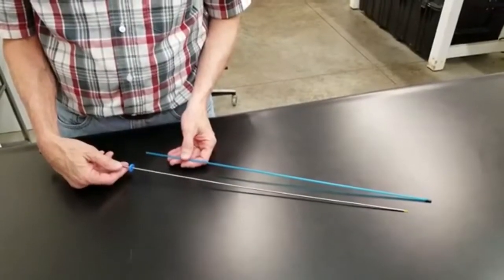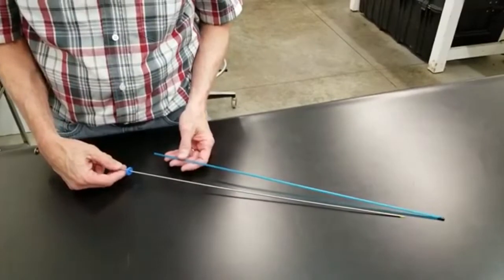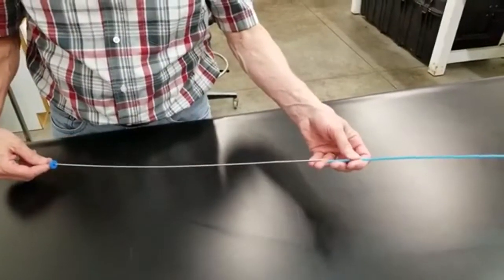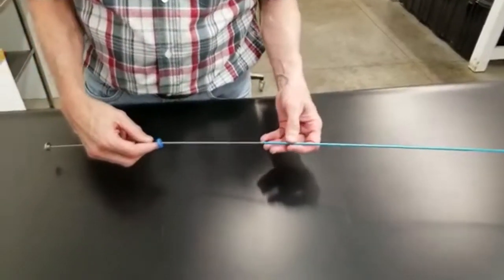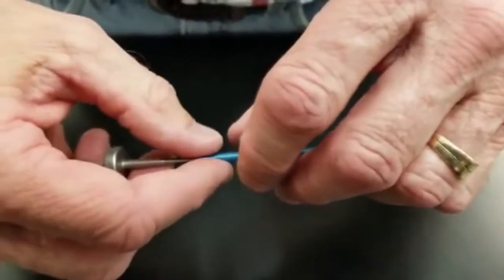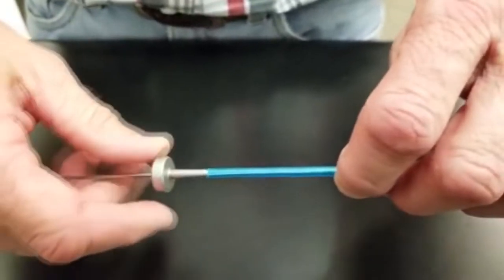I'd like to demonstrate the preferred method for pulling the plastic sheath, the embryo transfer sheath, down and over the transfer rod. Once you get to this location, you move the doughnut ahead — there's the flange, the wider area.